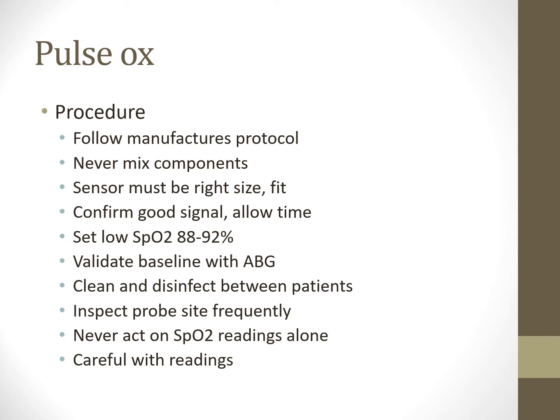Hopefully there's waveforms on all the pulse oxes that you're reading. Most pulse oxes nowadays will have the waveforms, so you can sort of see how strong of a signal it's getting. If you got almost no signal and it's getting a very poor reading, I would not trust it. So look at the waveforms, look at the pulse, look at the signal, and sort of see where you're at. Set the low saturation around 88% or 92%, depending on what patient population you're working with.